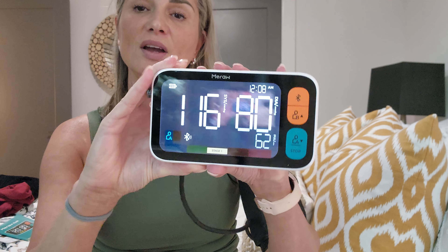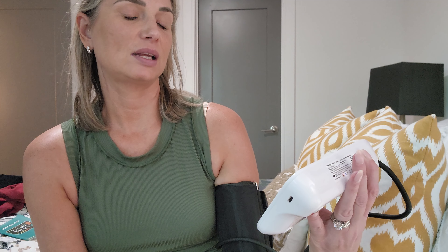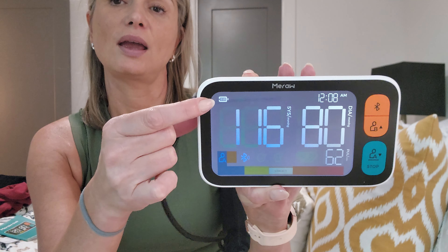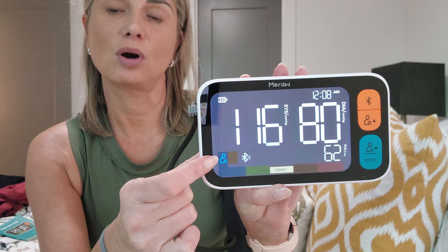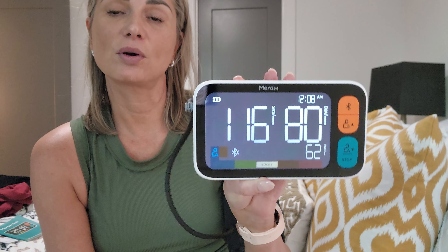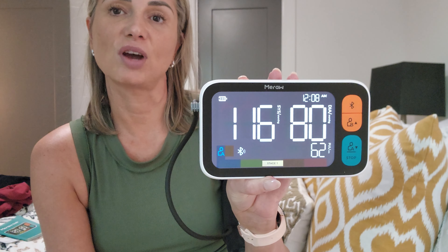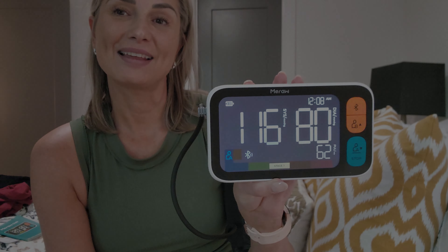There's my reading: 116 over 80, pulse rate 62. I haven't set the time yet, but it also gives you a battery level indicator, shows the Bluetooth status, and confirms you are Participant A. All of this can be recorded through the app so you can keep track of all your measurements. I think this worked out great.